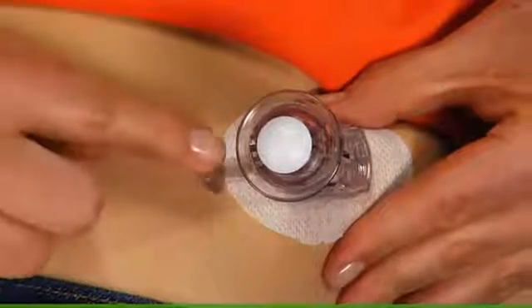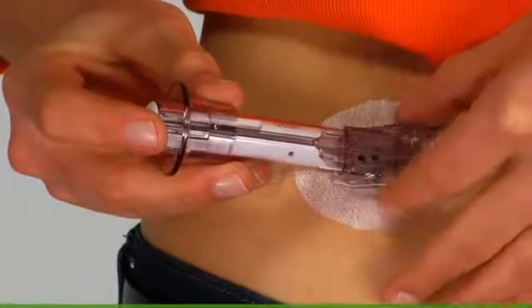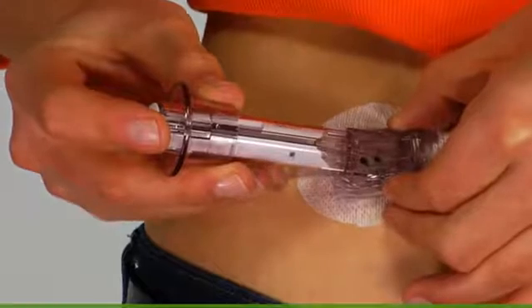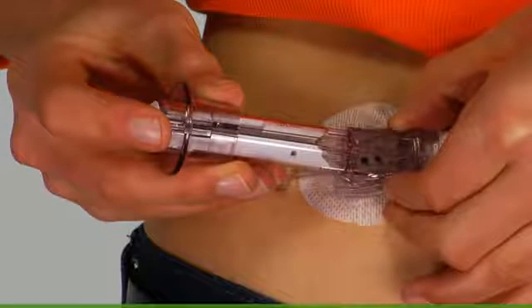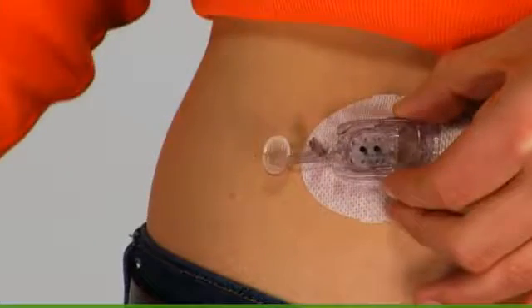Make sure the transmitter latch is flush against the skin. While still holding the sensor applicator, use your other hand to squeeze the ribbed tabs on the sides of the sensor pod. Rock the sensor applicator forward and out, away from your body.